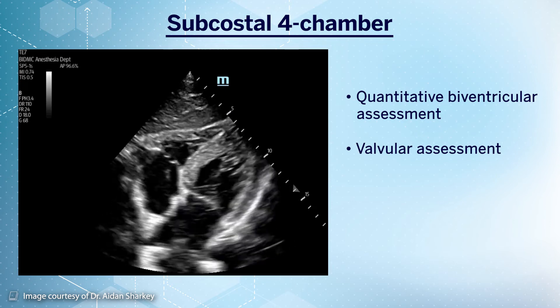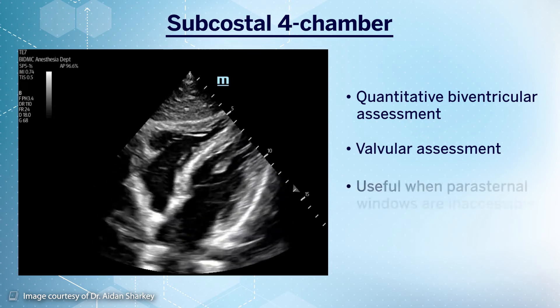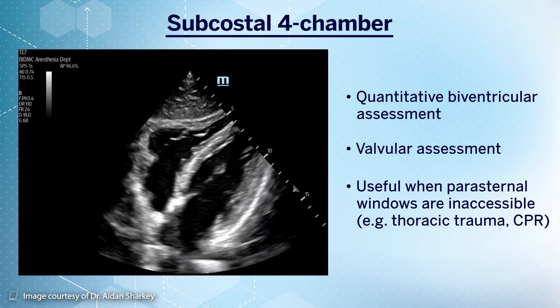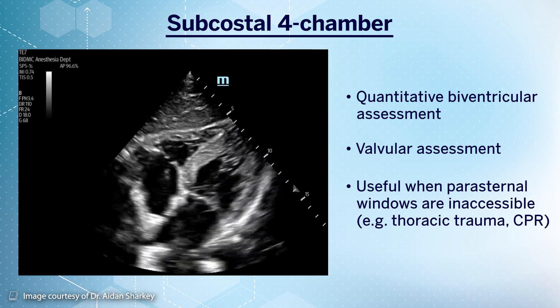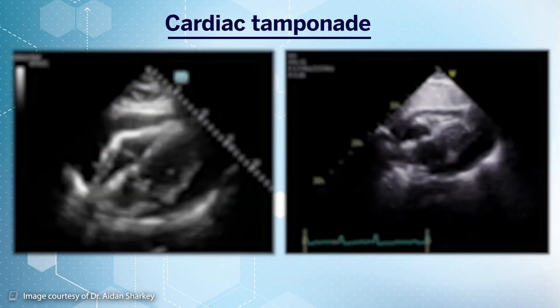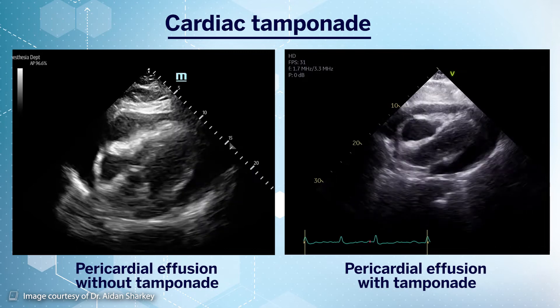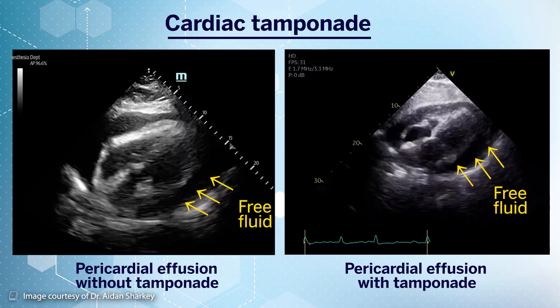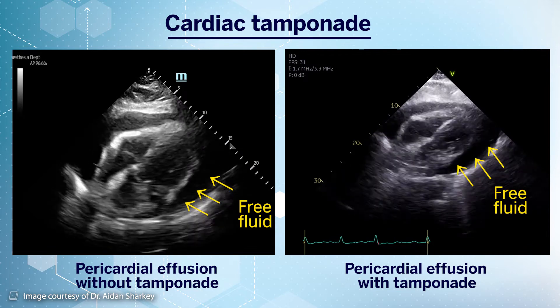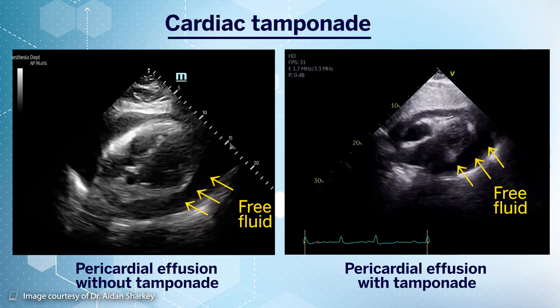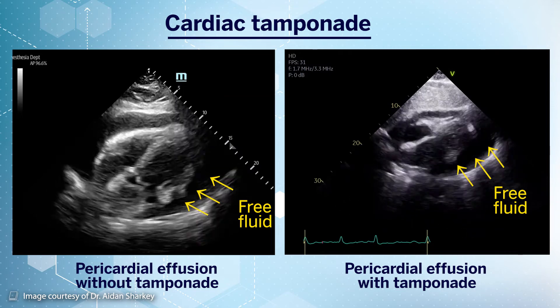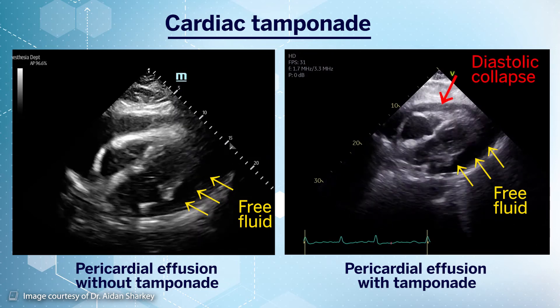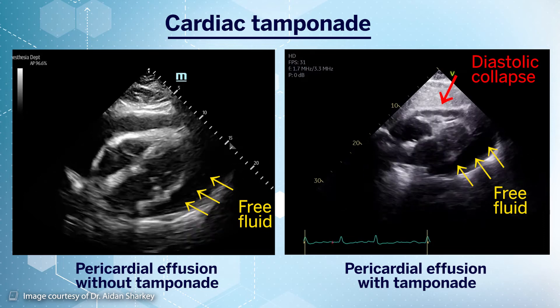It can also be useful in thoracic trauma where parasternal windows may not be accessible, or if there are ongoing resuscitation efforts limiting front-of-chest access. This view is also particularly good for evaluating free fluid in the pericardial space, as shown in these videos where we see free fluid depicted by the yellow arrows. In both video clips we can see a circumferential fluid collection, and one distinguishing feature suggesting possible tamponade physiology is right ventricular diastolic collapse, as seen on the video to the right of the screen.